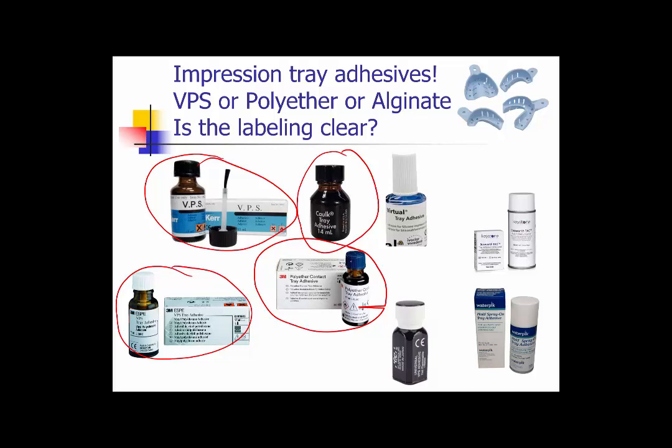And so knowing the tray adhesive and then reading. The Virtual tray adhesive from Ivoclar is for silicone impression materials. And silicone means VPS or vinyl polysiloxane, or PVS, same thing, polyvinyl siloxane, or there are other silicone impression materials, but not for a polyether, not for a rubber base. And then if you're using alginate, you're using special adhesives for alginate that are either paint on or spray on, but those are not meant to be used with vinyl polysiloxane or polyether, strictly for alginate impression materials.